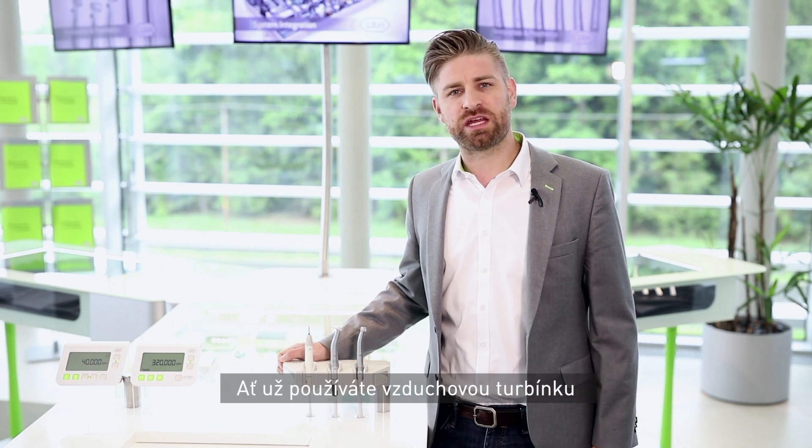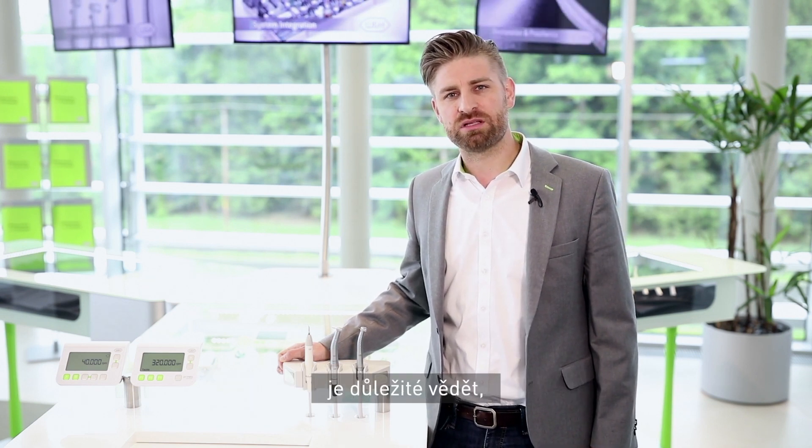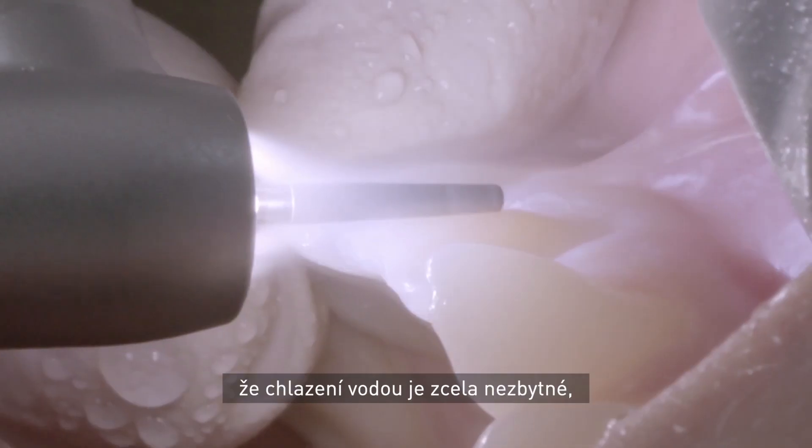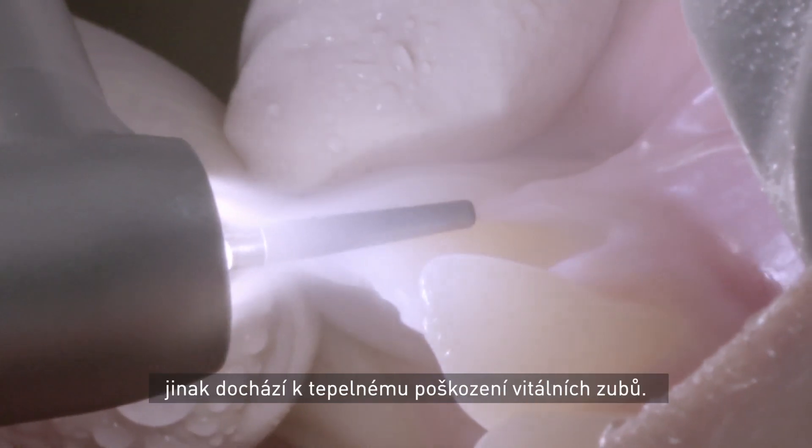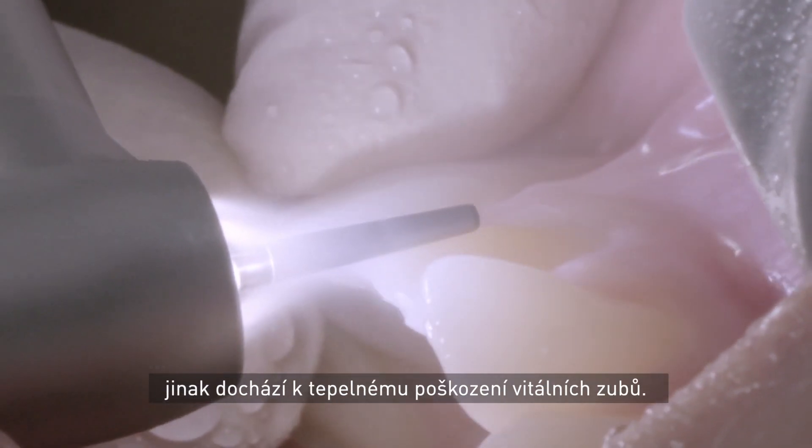Whether you use an air turbine or electric high-speed handpiece, it's important to understand that the spray is needed to cool the treatment area to avoid thermal damage to vital teeth.